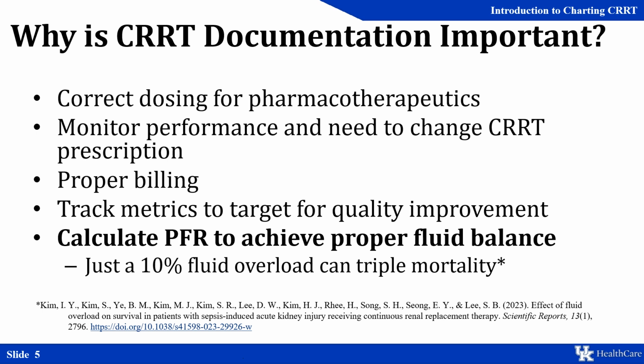Another reason that documentation for CRRT is important is to monitor the performance of our current prescription and make adjustments as needed. For example, a prescription may offer a good effluent dose to the patient in theory, but if it's causing many undue alarms that are interrupting therapy, it may be time to change that prescription.